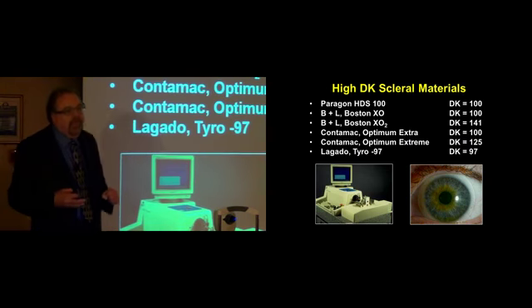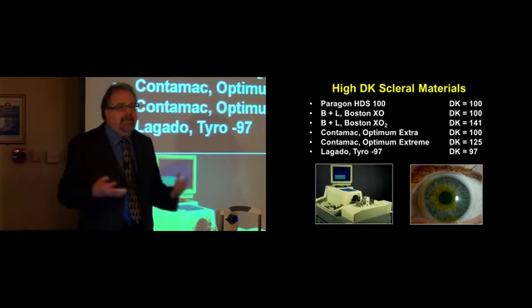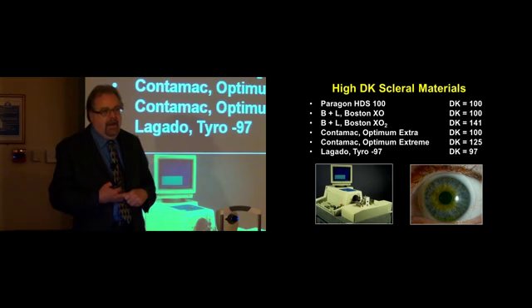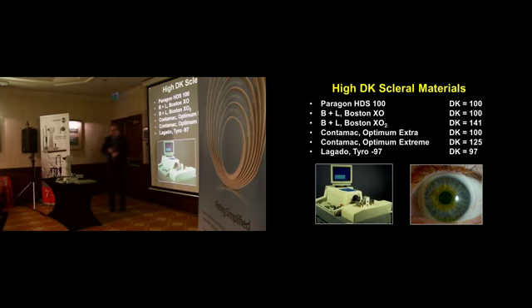The second innovation has been the change in lens materials. We now have high Dk contact lens materials that can provide oxygen through these thicker scleral contact lenses.